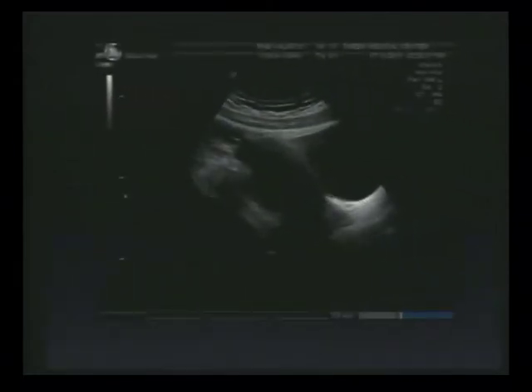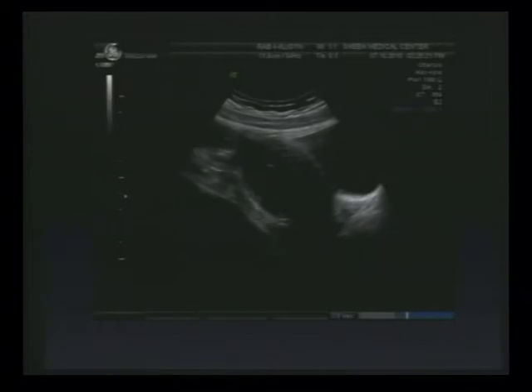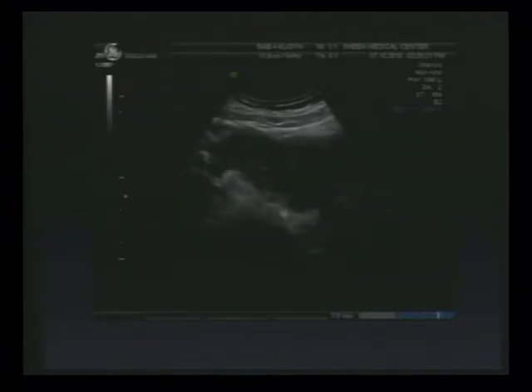This is a recent case. I'm afraid that there is too much light in here. You can't see the sonographic picture here, but this is an elongated cystic lesion with incomplete septa within it. Do you all see the sonographic imaging?